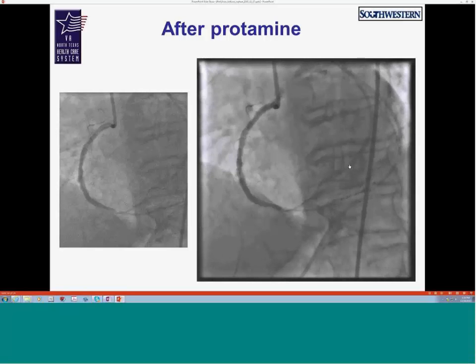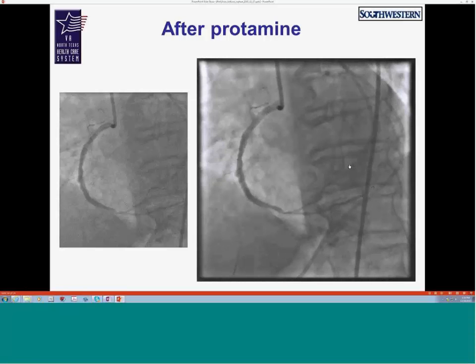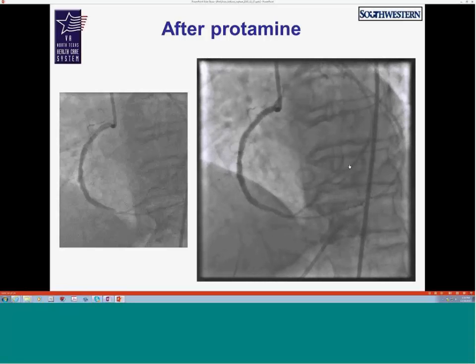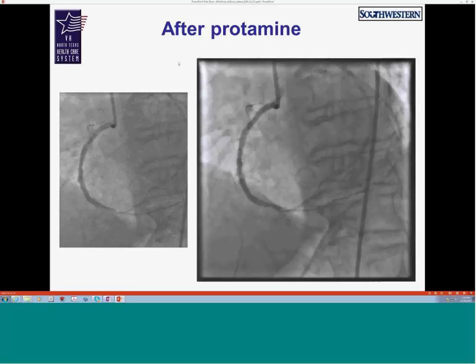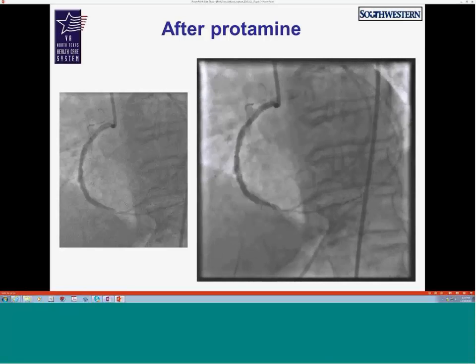It's interesting that everyone says the cover stent is a solution. That's true. But my impression here was that the cover stent may be very hard to deliver, especially in those CTOs with all this stent and calcification and tortuosity and things like that. Yeah, well said. So the bottom line is, what do you do in this case: long balloon inflations. We did call the surgeons, who were not very excited about going in.